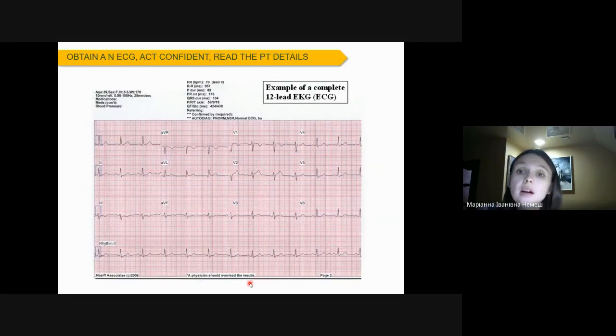So here you have an example of the 12-lead ECG. Here are present the first 3 standard leads, first, second, and third. Also 3 augmented leads, AVR, AVL, and AVF, and the 6 from V1 to V6, the precardiac leads. Also in the ECG trace, you could identify the heart rate, which the ECG device measures independently, and the duration of the RR, the QRS, and QT complexes.